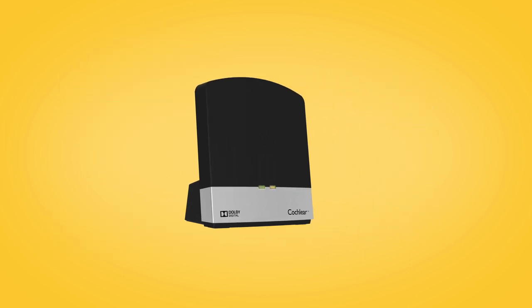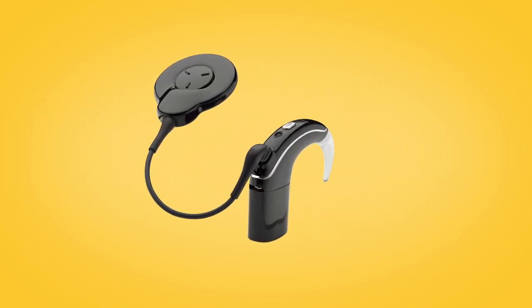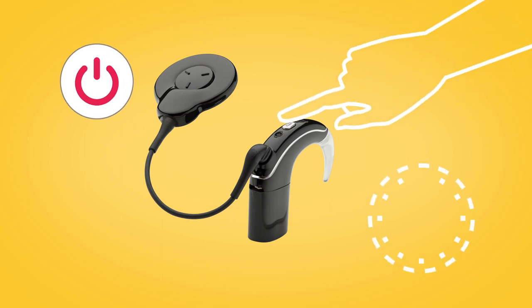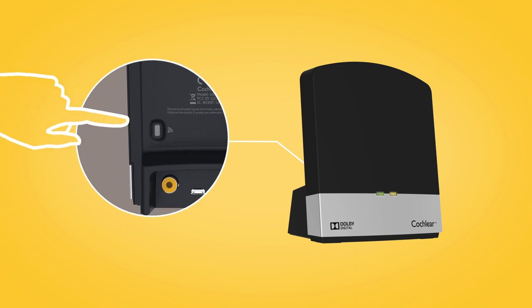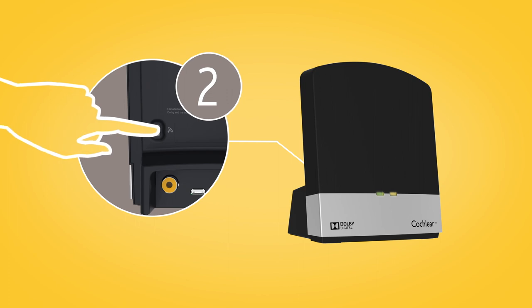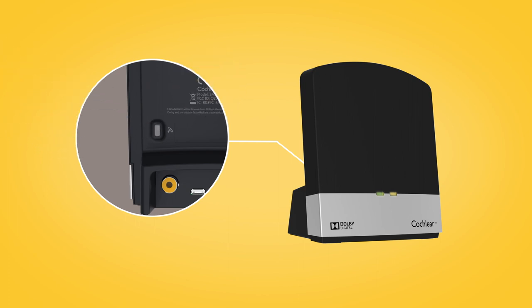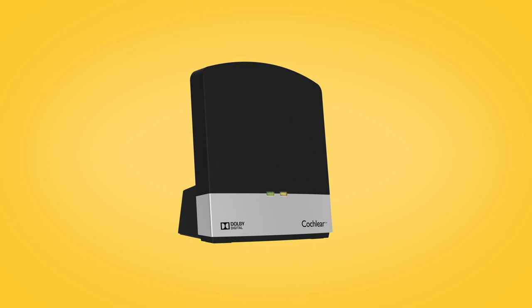To pair your TV streamer with your Nucleus 7 sound processor, remove and turn off your sound processor, then press the pairing button on the back of your TV streamer once, twice, or three times depending on which channel you want for the TV streamer. The TV streamer's activity indicator will flash orange to indicate it is in pairing mode.